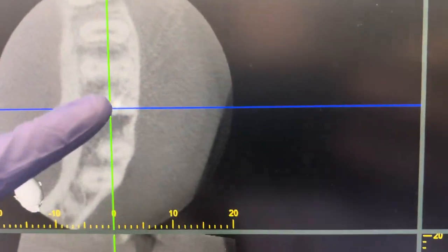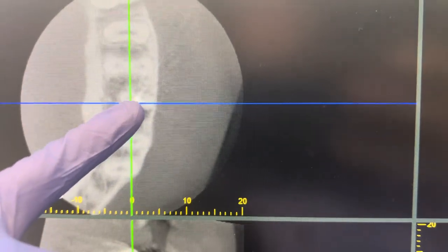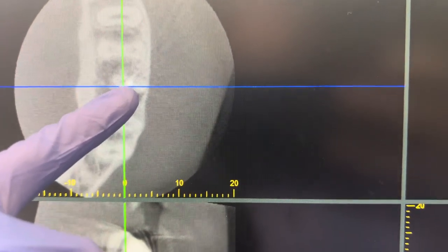Well, this root canal that was done, if you look real close, you see a tiny little black dot, a white circle, and a tiny little black dot. The black dots are where the root canal should have been done. The white dot is where the root canal was done.